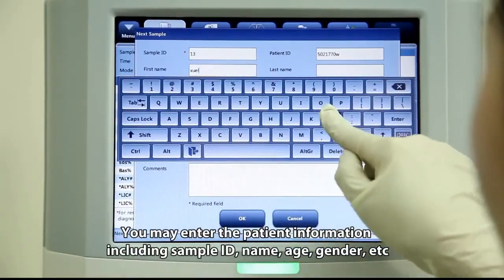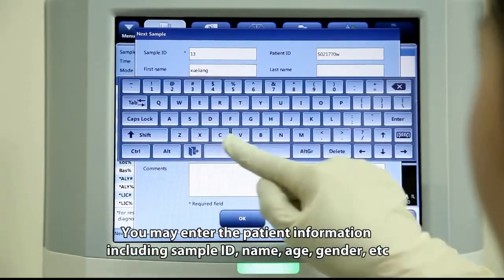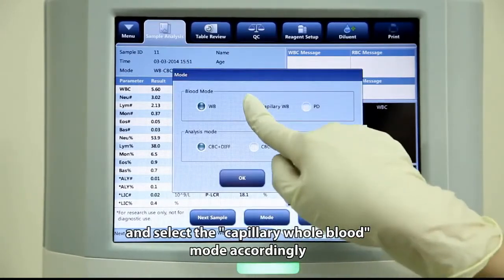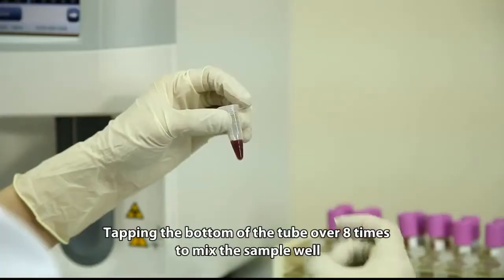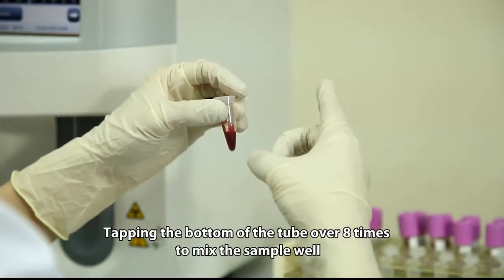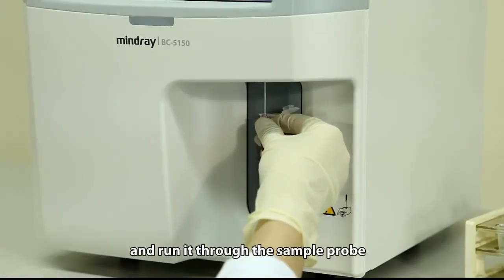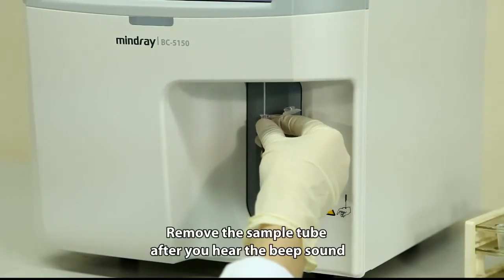Enter the patient information including sample ID, name, age, gender, etc., and select the capillary whole blood mode accordingly. Tap the bottom of the tube over eight times to mix the sample well, then run it through the sample probe. Remove the sample tube after you hear the beep sound.